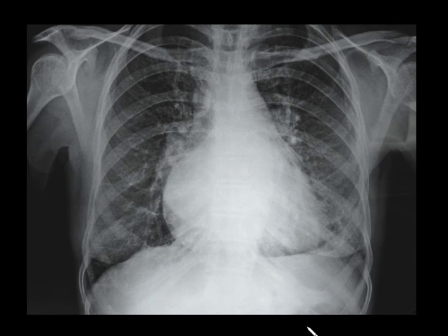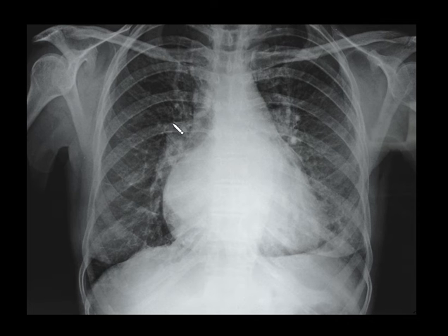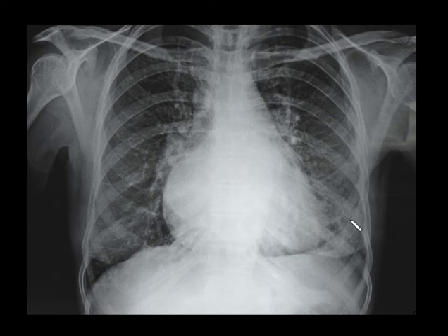Coming to the next spotter, you can see straightening of the left heart border, prominent left atrial appendage, a double density shadow in the retrocardiac location causing widening of the subcarinal angle, and mild perihilar congestion. This is a classical case of mitral valvular disease, likely due to mitral stenosis.